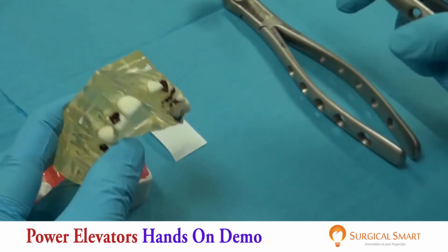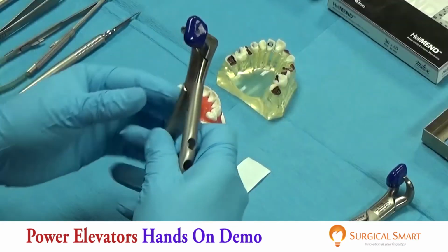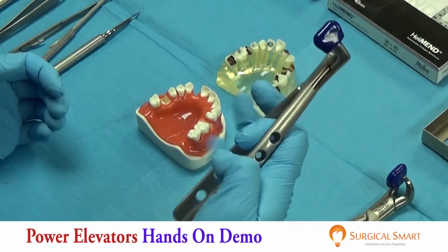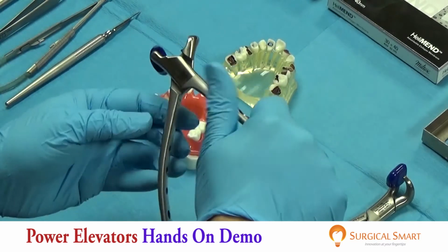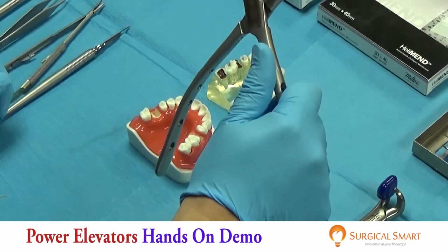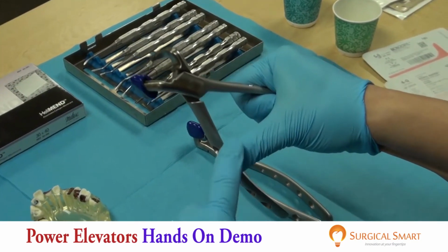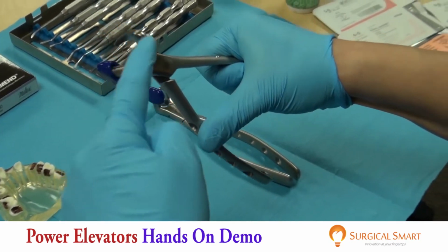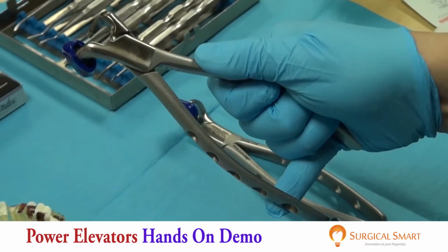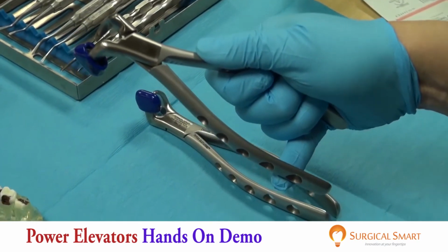Okay, now I wanted to just show you the way we handle these power elevators. The power elevators, you don't grab it as if you're grabbing a standard forceps. You actually grab the bumper part with the brunt of your hand. And then you simply use your thumb or your pinky to stabilize the hook end. So the hook end is actually just being stabilized by a thumb or a pinky. Okay? And so let me demo it. We're gonna have the camera zoom out a little bit so you can see what I mean.